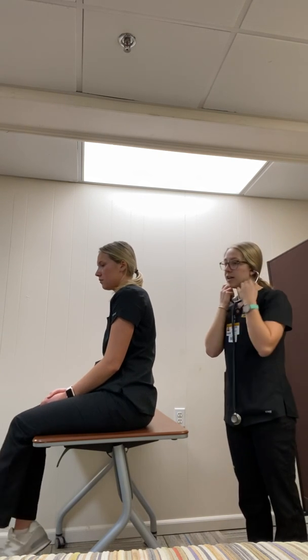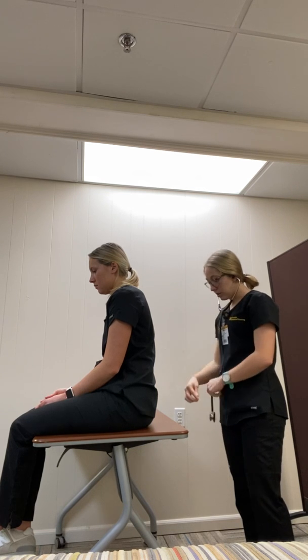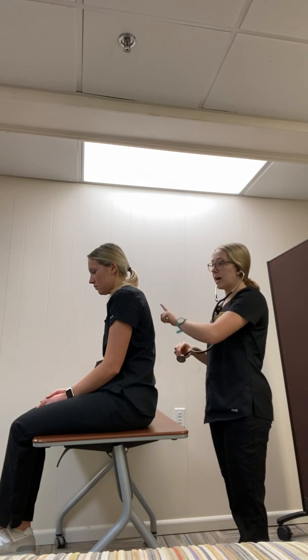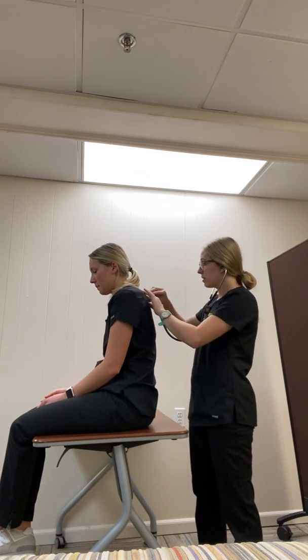So now I'm going to auscultate on your back here. Normally for any of the auscultations, I would be doing it under the clothes, but for the purposes of this video, I'm just doing it over the clothes. I'm just going to go around her scapula here, 4 points on each side. Haley, I'm going to have you take a deep breath at each point of the stethoscope, okay? Okay.